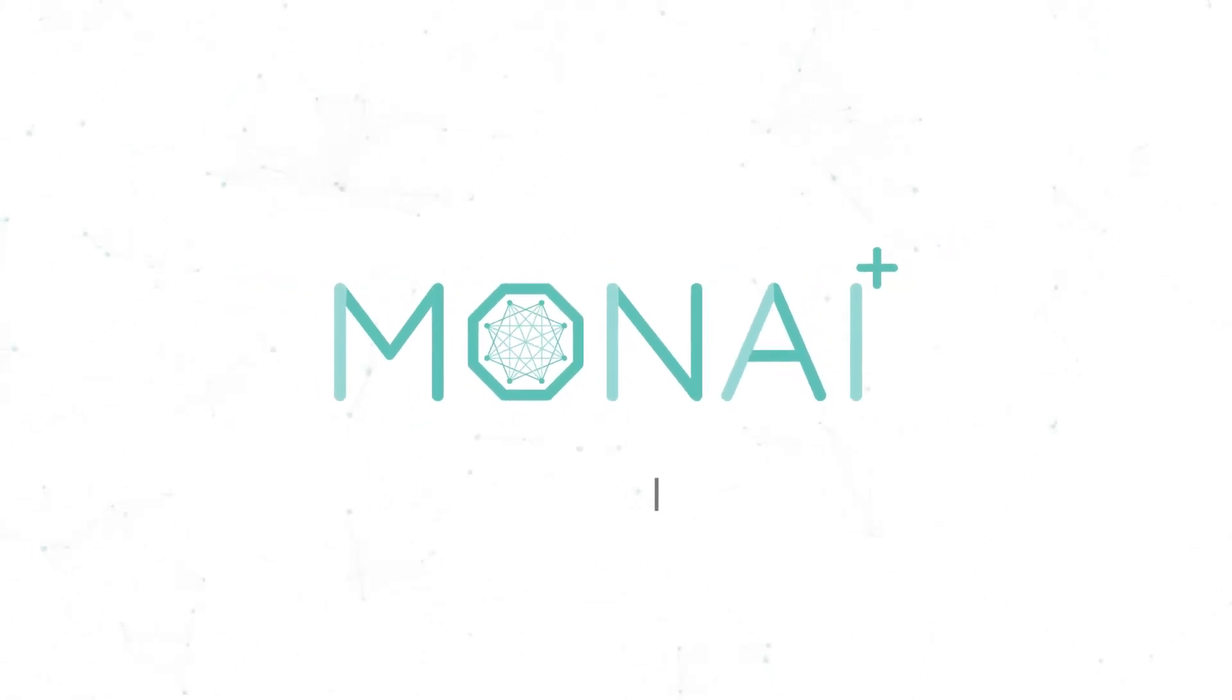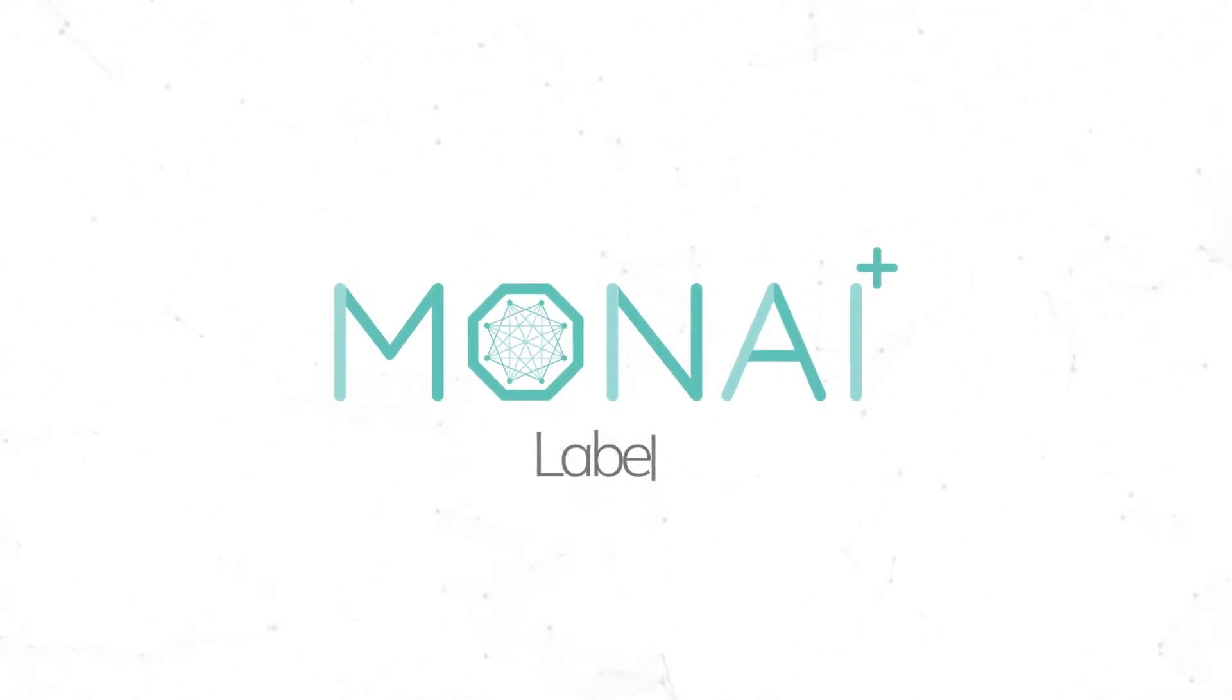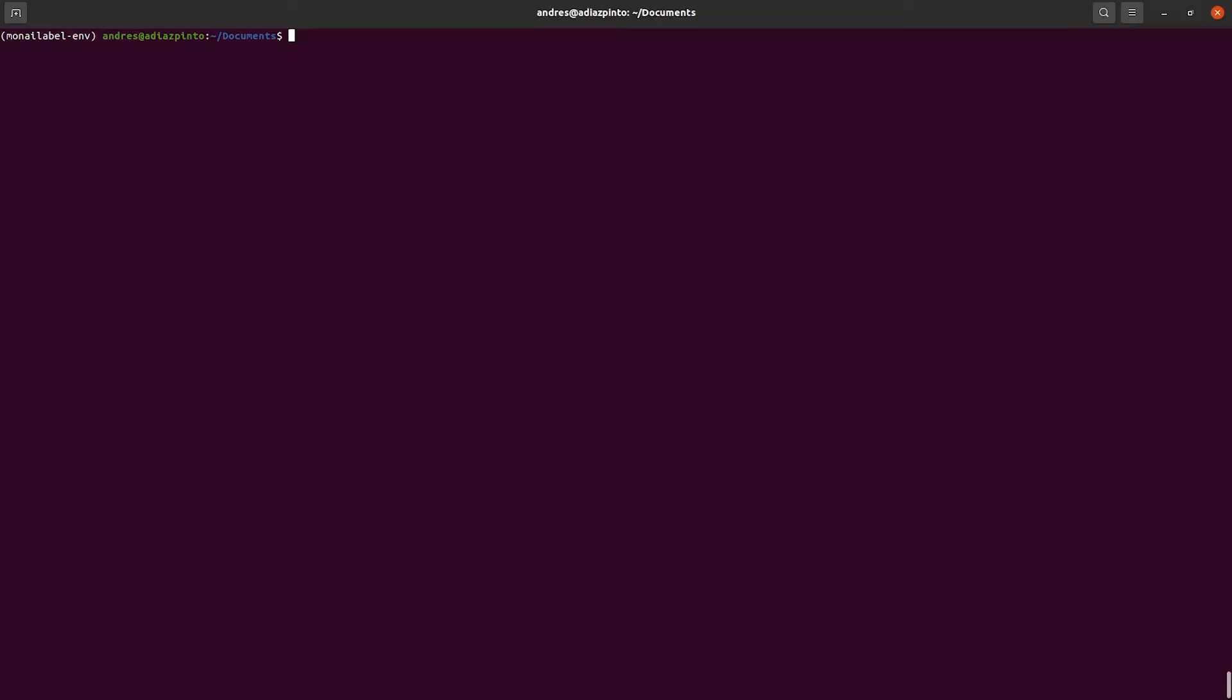Hi everybody, in this video we're going to show you how you can use Scribbles algorithm. Let's get started.